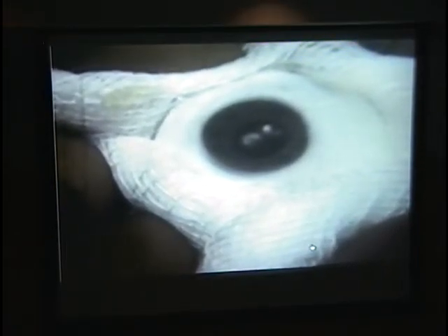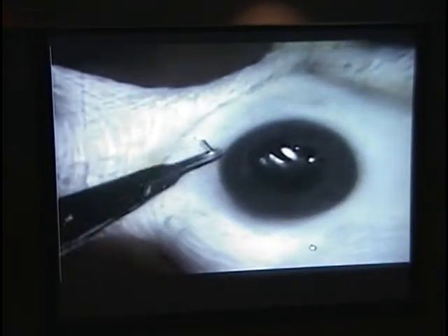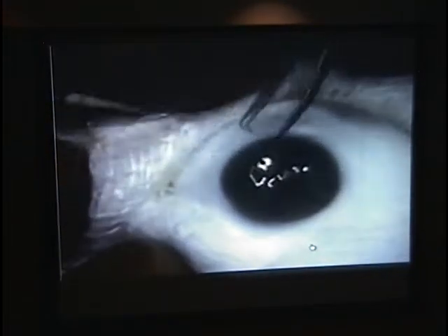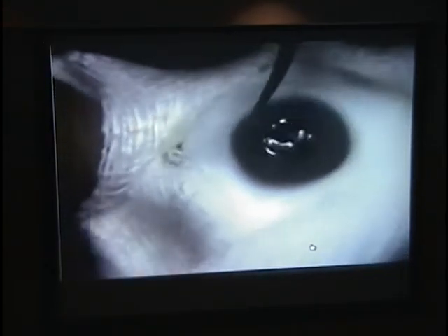The epithelium is scraped from the donor eye, except in certain cases, such as chemical burns, where one hopes to preserve a maximal amount of epithelium. A hand-driven Castroviejo 7mm trephine is used to penetrate into the anterior chamber. A 10-0 nylon suture is placed through the edge of the donor button, which is then cut free using Castroviejo scissors. I have had no problem with promptly used refrigerated donor eyes.